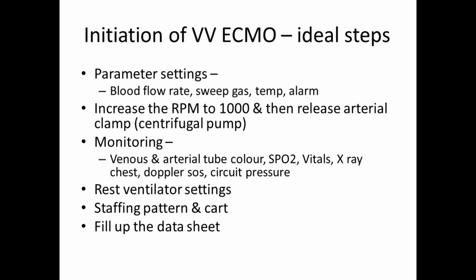As soon as you initiate it, you see the difference in color. If both tubes look the same color, if both are dark, it means your oxygenator is not functioning, or somebody has forgotten to connect the oxygen to the oxygenator. That is a possibility. So always check the color immediately as soon as you start. If both are too bright, that means recirculation is occurring. So that is what is most important.